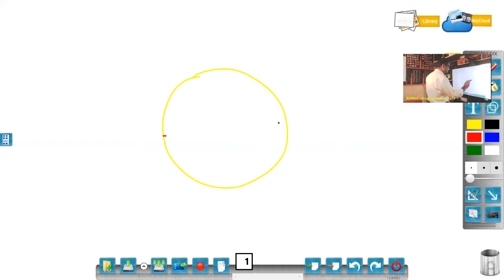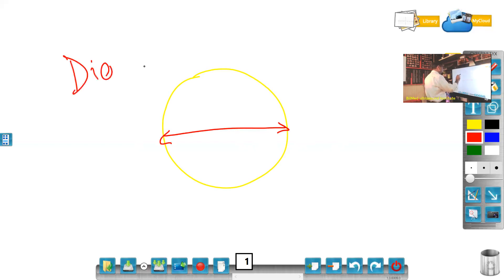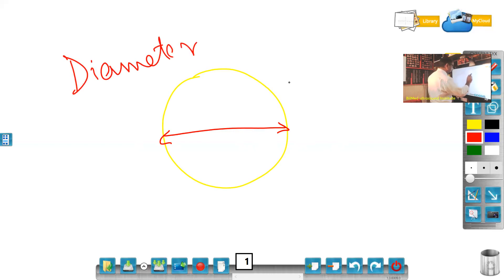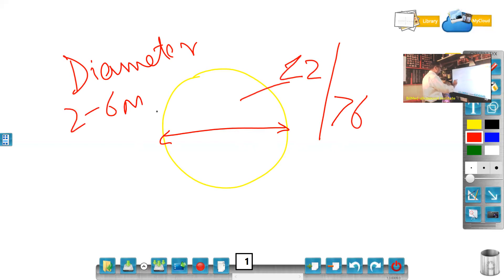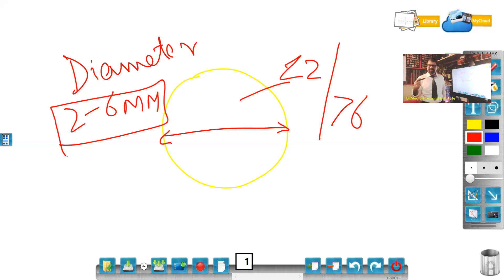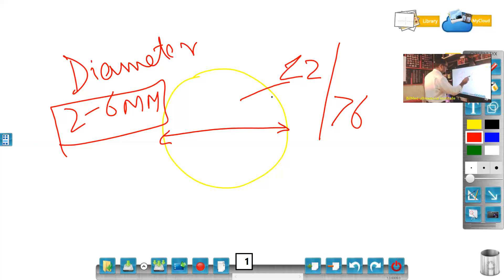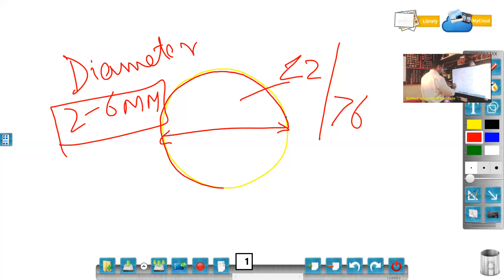How much is the diameter? The diameter of the yolk sac should not be less than two and it should not be greater than six millimeters. So the first point is that the diameter should be between two to six millimeters. Neither less than two will be accepted nor more than six is accepted. The second point is that the shape should be round — round only.